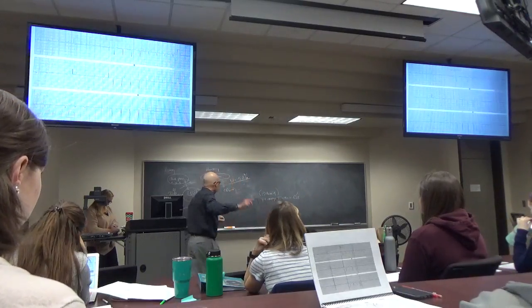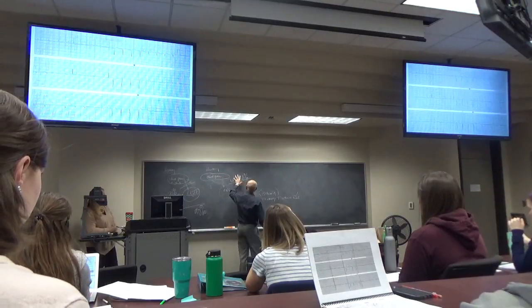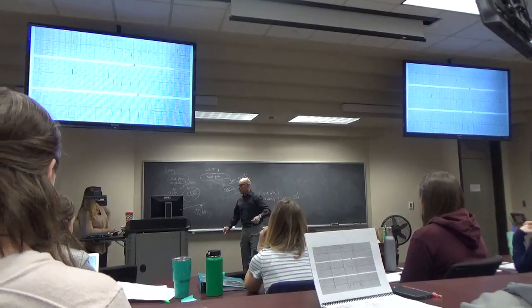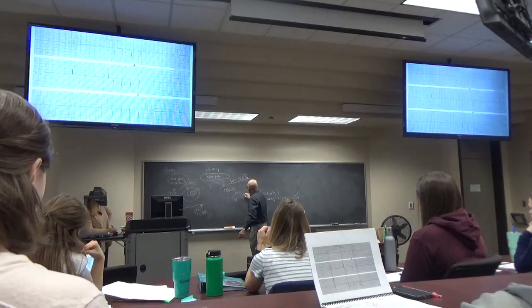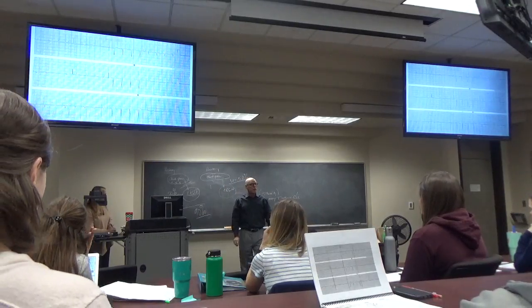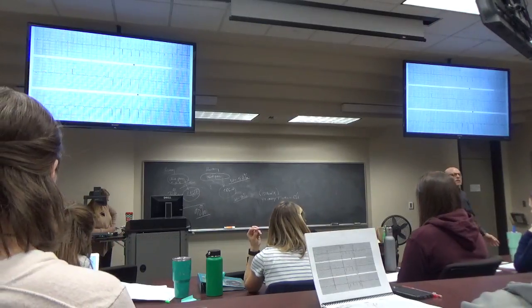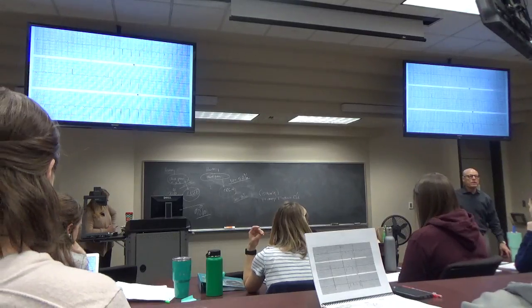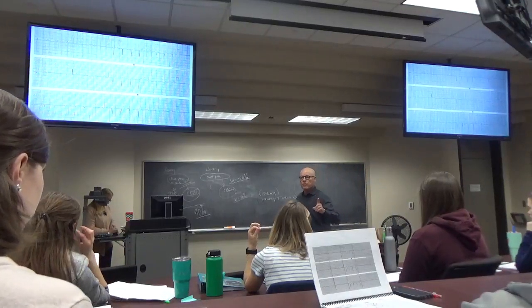But if you use the same number to turn this to this, you're going to have to use the same number to turn this to this. So it's going to go up, maybe 60 to 70. Now, isn't this interesting? What's the only difference in these two cases? The history. The only difference in these two cases is the history, which is why the history is the most important diagnostic information you're ever going to get.